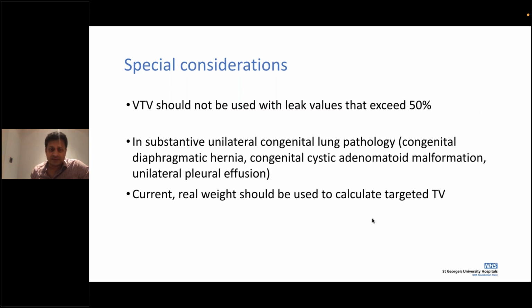For all practical reasons, please use the current weight as opposed to the birth weight. So with volume control, you must optimize week on week, and you must change the weight that is set on your ventilator, so the target that you've set is on the current weight or the working weight that you use.